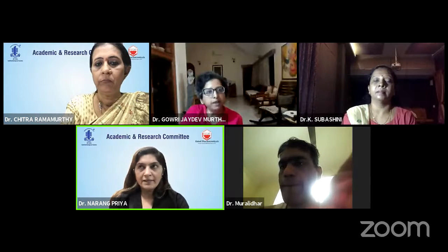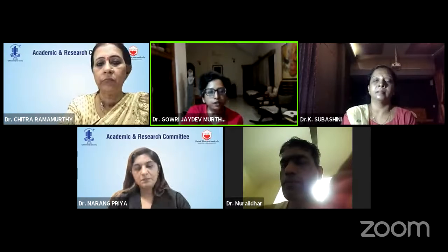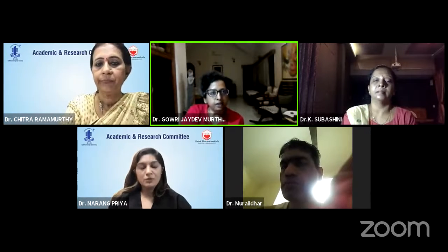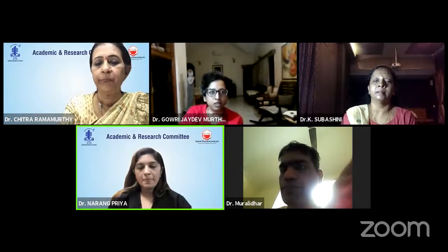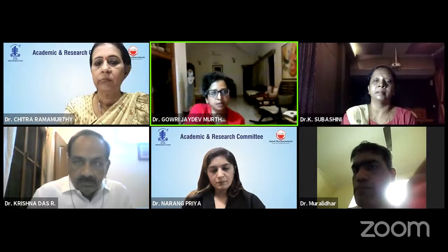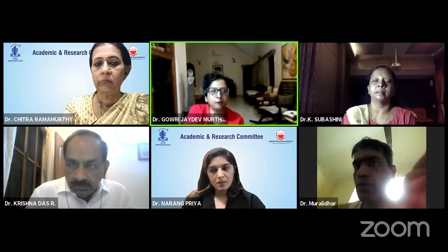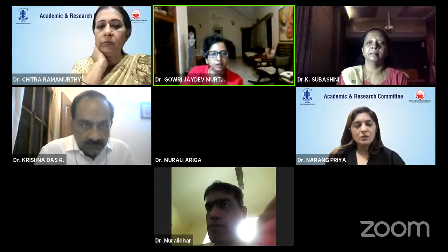There may be 10 players in the field right now, and there are only a few which are going to stand the test of time, and those are the ones which will come to stay. And we will definitely use this technology. So in the meanwhile, I don't think this can replace a Humphrey or an Octopus perimeter. It is like an add-on, for screening or something.